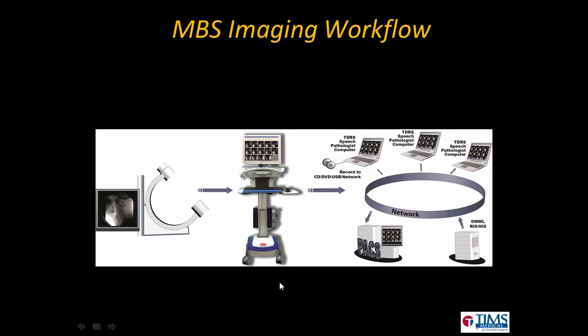In its most basic workflow, you can fluoro the patient. The TIMS system will record the study. You can review the study right here on the TIMS system in the procedure room, edit the study if you'd like, review, do patient education, and then send the study directly from the procedure room onto PACS.